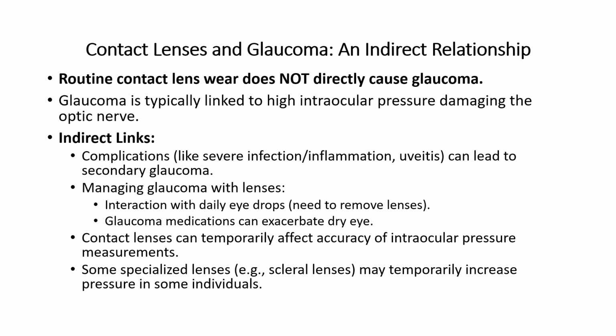For individuals already diagnosed with glaucoma, wearing contact lenses requires careful consideration, as many use daily eye drops, and lenses often need to be removed to apply drops, potentially impacting medication adherence. Some glaucoma medications also worsen dry eye, making lens wear less comfortable. Contact lenses can also temporarily alter corneal shape or thickness, potentially affecting the accuracy of intraocular pressure measurements. Additionally, some specialized contact lenses, like scleral lenses, have been shown in some studies to temporarily increase intraocular pressure in some individuals during wear.